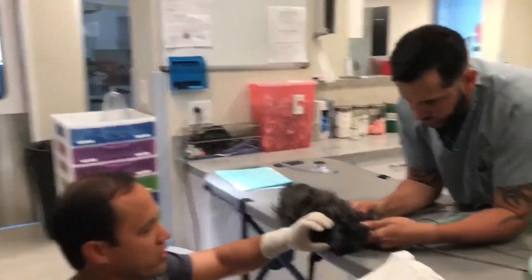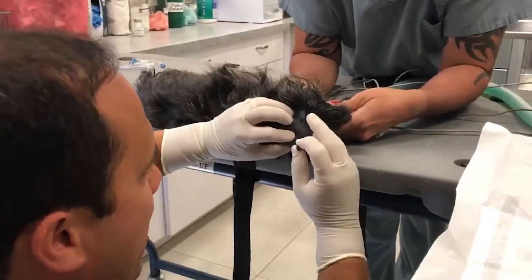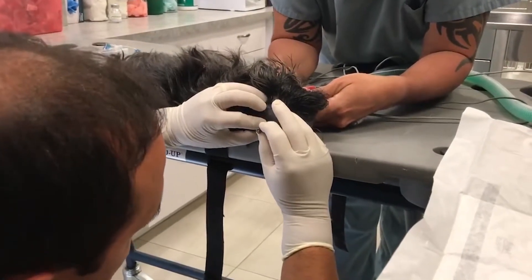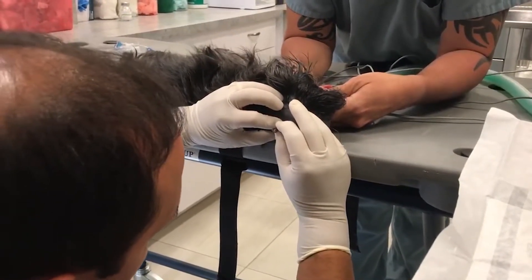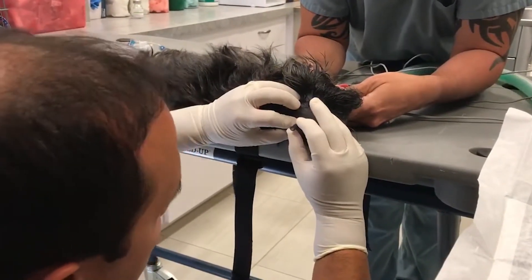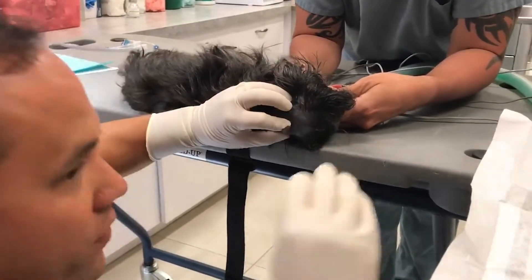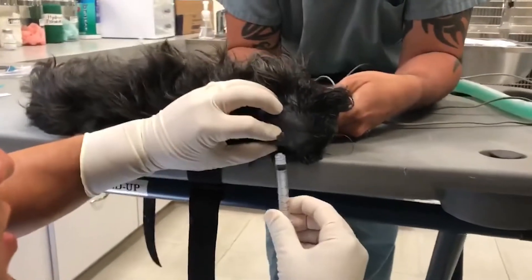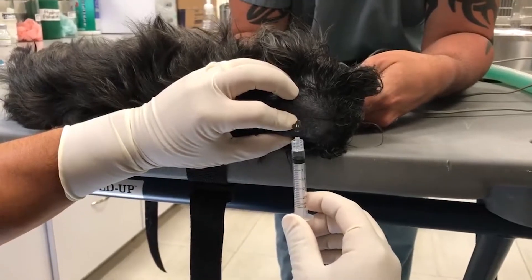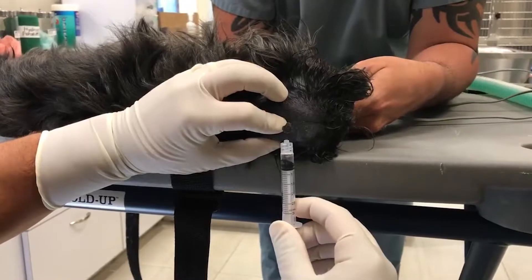Our patient is under anesthesia here, and Anthony's going to keep holding her immobilized. We use the needle with specific landmarks to collect fluid. We let the fluid just slowly drip out — you can collect it into a tube, or as I'm doing here, I use a syringe to collect it drop by drop.